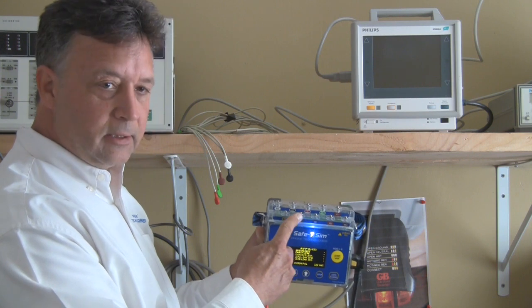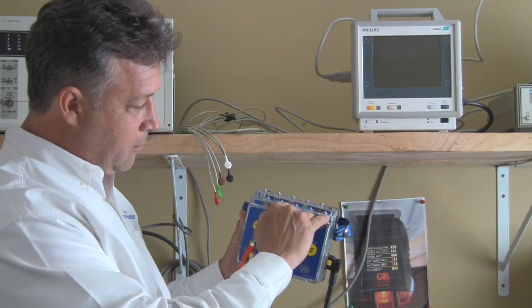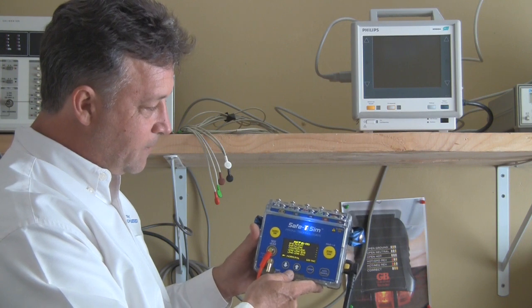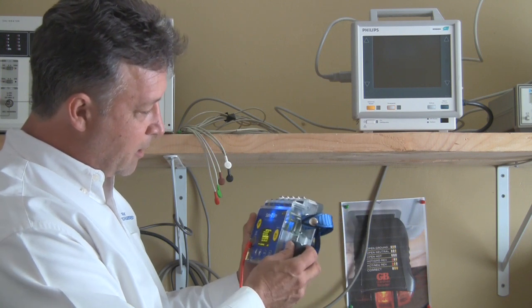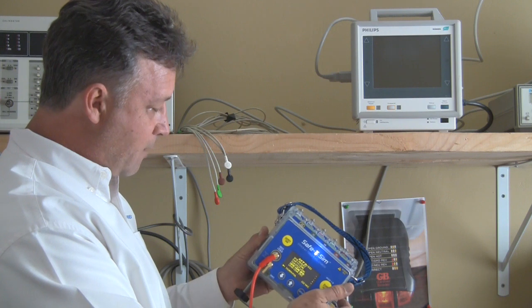You've got 10 ECG snaps across the top with our patented banana plug grooves that allow you to hook up banana plugs from an EKG card directly underneath the ECG snap to get a solid connection. You've got your input power connector and a nice handle at the top to grab it and go.